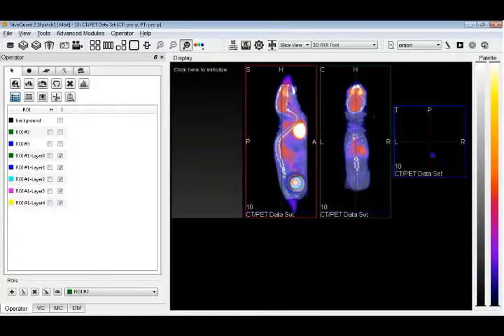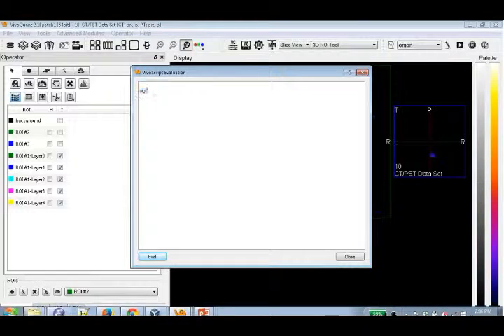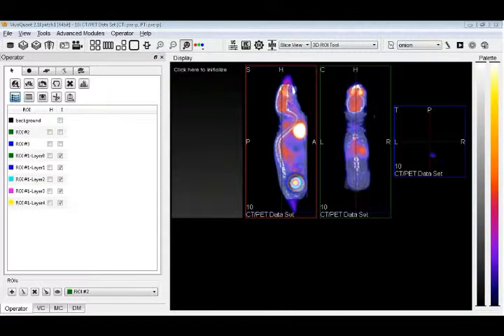Is it possible to output messages? Yeah. So, I'll go first. Better than the hello world. So it's right here. It's a special mode that allows you to pause the script, and while that message is showing, the user can actually use the interface. That's very useful if you have, for instance, QC steps, like was that co-registration, has that worked?